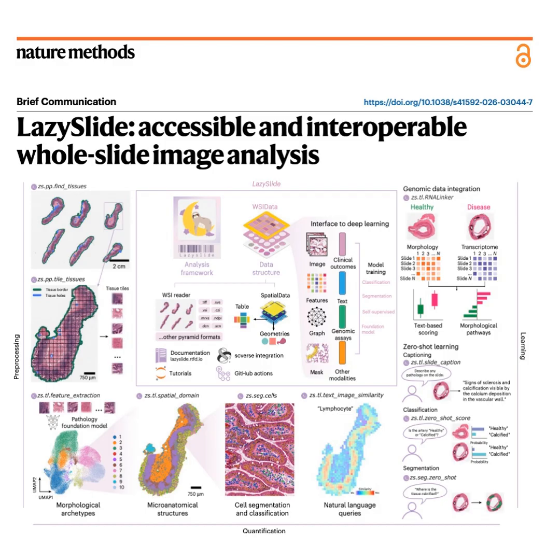Unbelievable. If a researcher serialized a standard cohort of just a few hundred slides, their disk usage would spike by 5 to 10 times. Wow, 5 to 10 times. Yeah. In a high-performance computing environment, that kind of data bloat will literally paralyze a shared storage cluster. You're essentially copying an entire library of encyclopedias every time you just want to add a single footnote. Which is completely unsustainable. But LazySlide bypasses this entirely with a custom data structure. It's called WSIData. Right, WSIData. It builds directly on top of this scverse ecosystem.